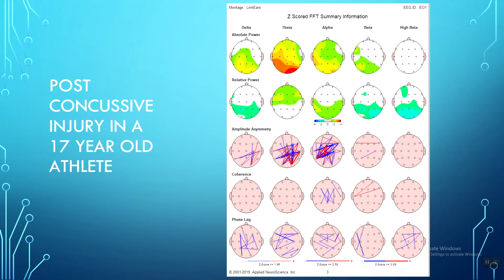And part of this game is going to be detecting what's not real, figuring out with the naked eye and with maps what's not real, because there's false positives in a lot of places. But if the brain were that malleable, with the exception of circadian rhythms, I don't think that. So no, the brain doesn't change much, unless you push it to change.